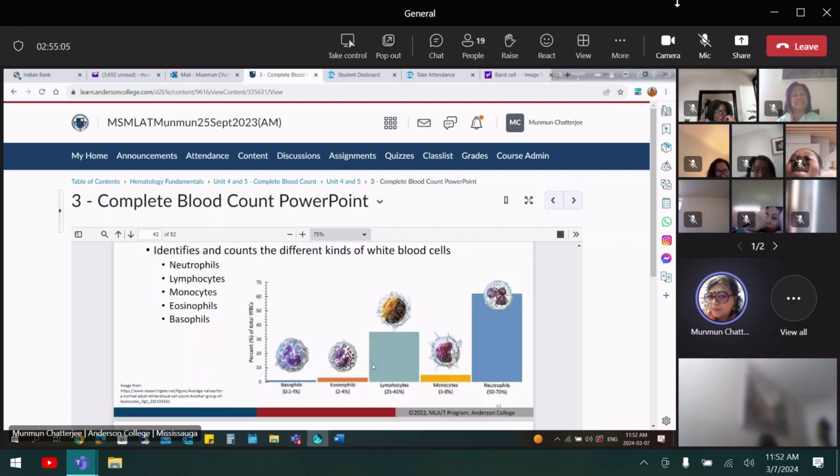Once again, here you can see the better structure. See the lymphocyte. That structure is wrong. So neutrophils have the segmented nucleus. Monocytes look like this one. And basophils have very dense granules. Eosinophil has only pinkish granules and it has a bilobed nucleus. Eosinophil has a bilobed nucleus, and this is kind of C-shaped or sometimes S-shaped in the basophil.